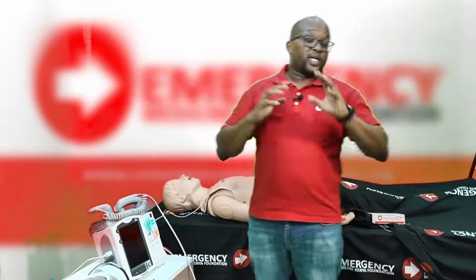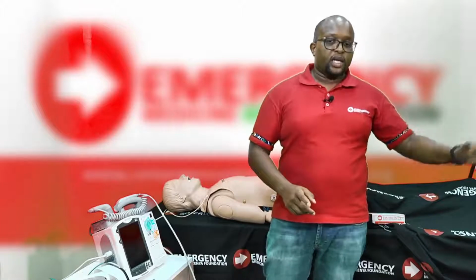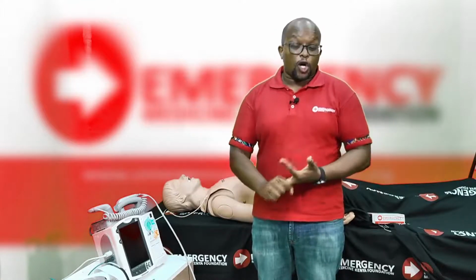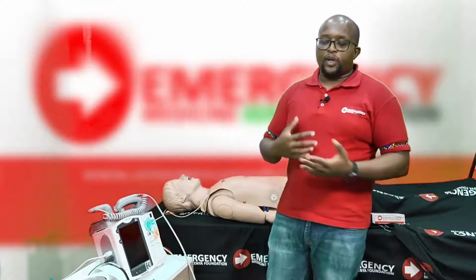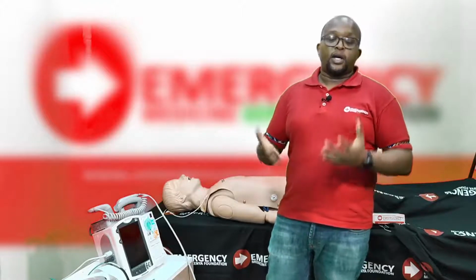All right. So in summary, synchronized cardioversion is for patients who are alive. That's the first part, okay? So the first thing is they're alive compared to defibrillation where they're dead. So in this situation, there's no CPR ongoing. Patient has a very fast heart rate, above 150 in adults, above 180 in pediatrics. Patient has features of shock, okay? So they are hypotensive, altered mental status, short of breath, chest pain, okay? So any of those clinical features suggestive of shock, then they are a candidate for cardioversion.